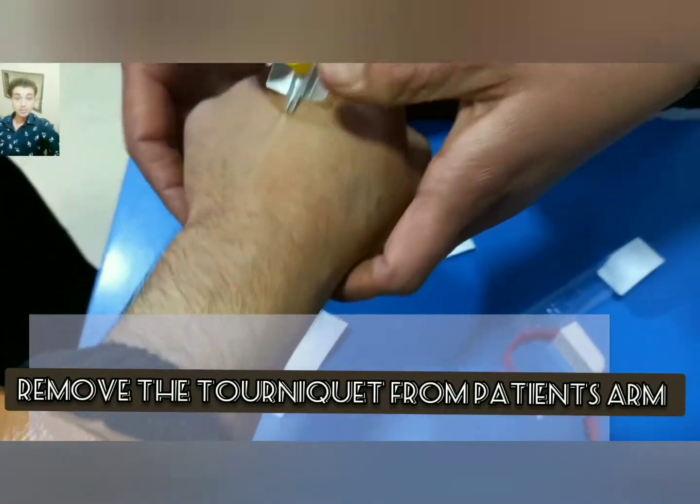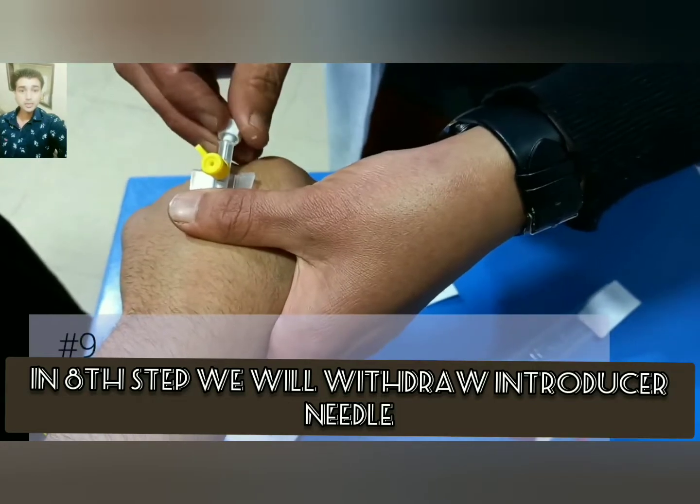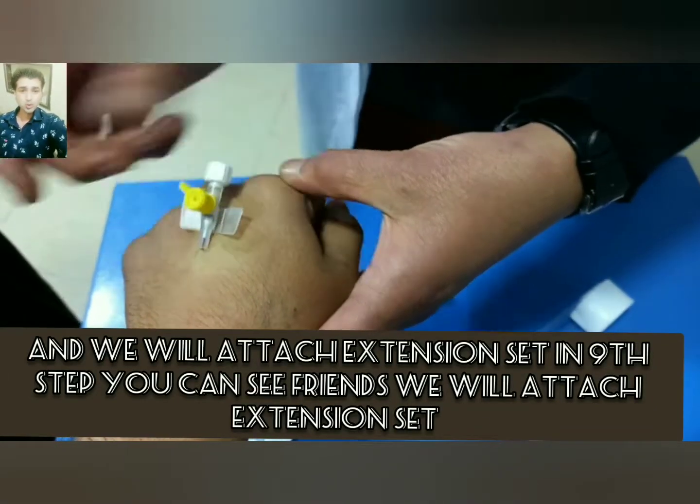Remove the tourniquet from the arm. In the eighth step, we will withdraw the introducer needle and attach the extension set.